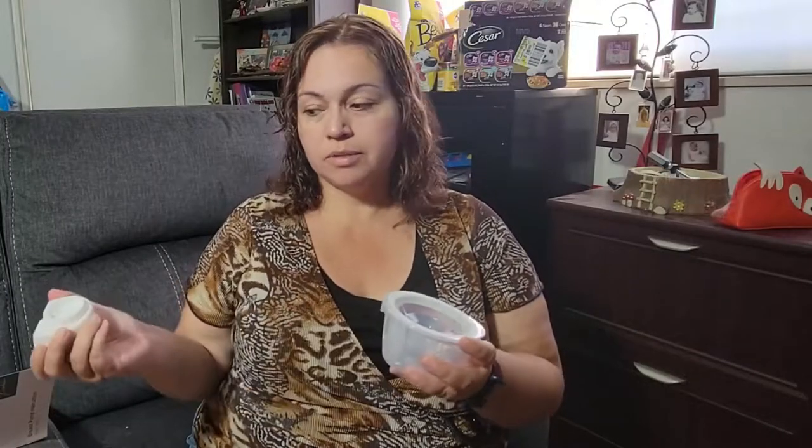Once you're ready to pour or clean it, simply take this off, pour out the milk, and then you can wash it with some warm soap and water and have it ready for the next use.